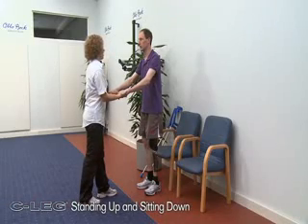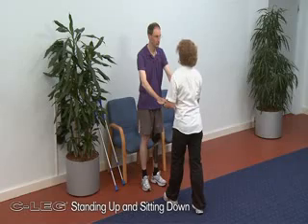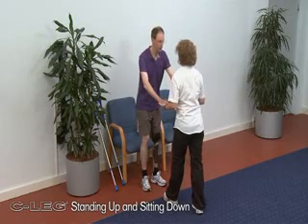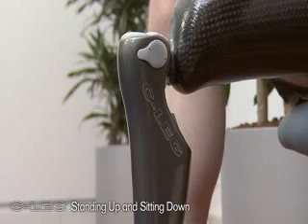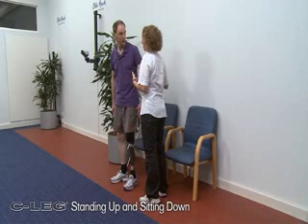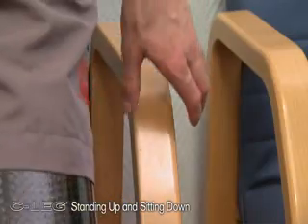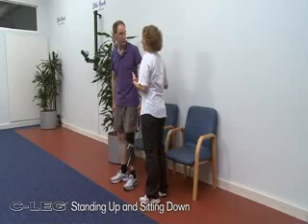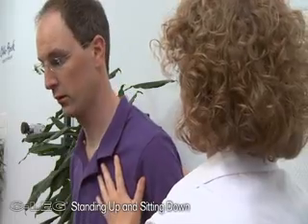First, the therapist supports the patient by holding his or her hands. The chair is positioned so that it is braced against a wall and both feet should be at the same level. Now the patient is asked to bend forward while pushing the buttocks back and allowing the C-Leg to support them while it flexes. Once the patient has gained confidence in the prosthesis, he or she can try to sit down independently by using the armrests for support.